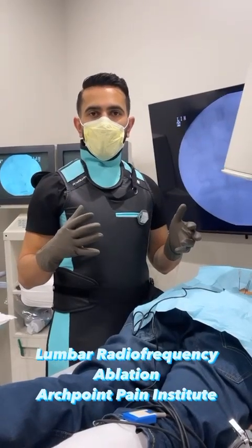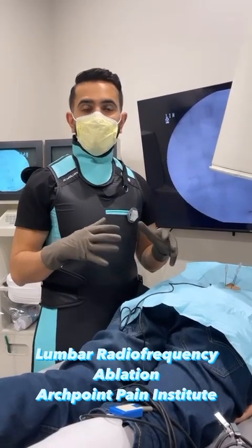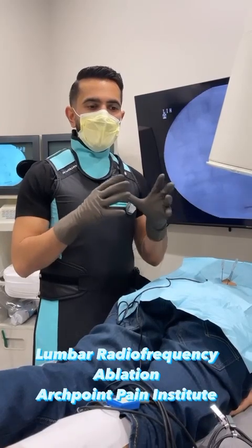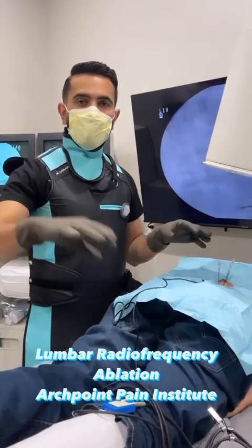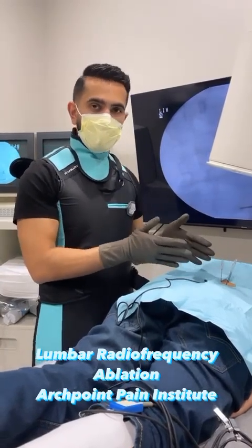We're doing a procedure called radiofrequency ablation, which is an injection in your lower back to help folks that have had chronic back pain. This is predominantly for folks that are having pain localized to the back versus sciatica pain. This focuses just on the arthritic pain in the back.